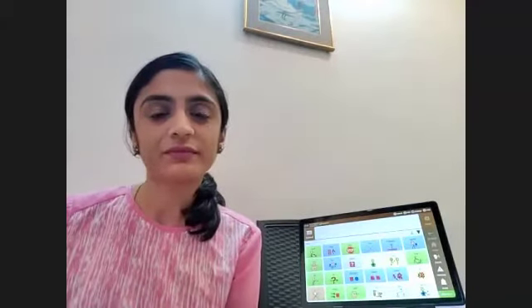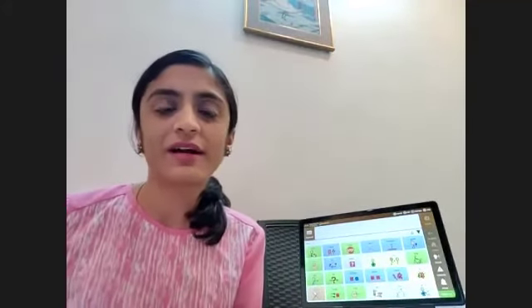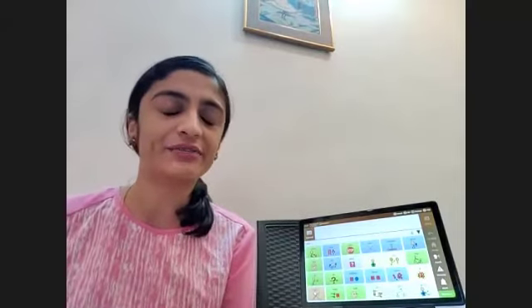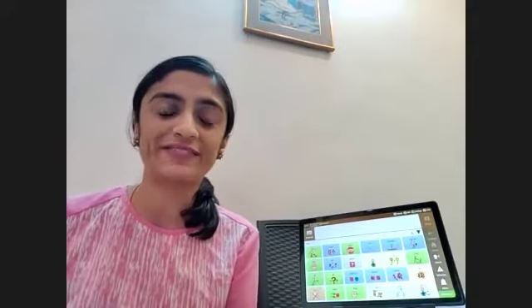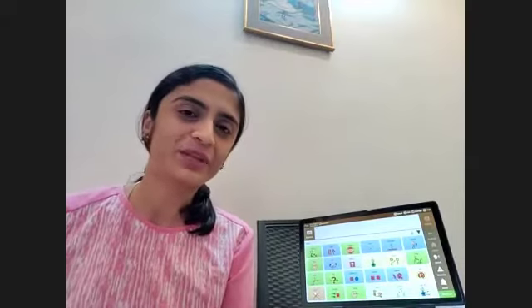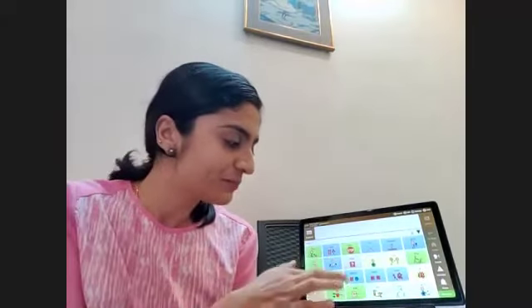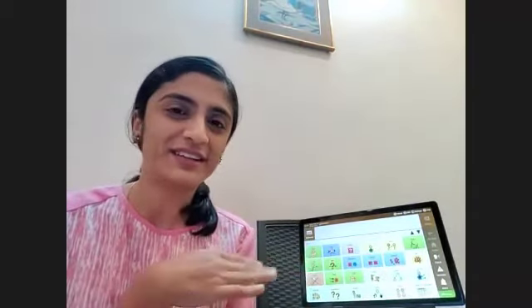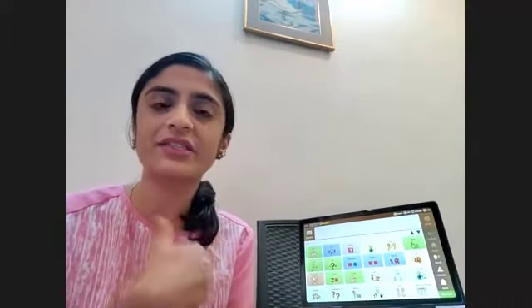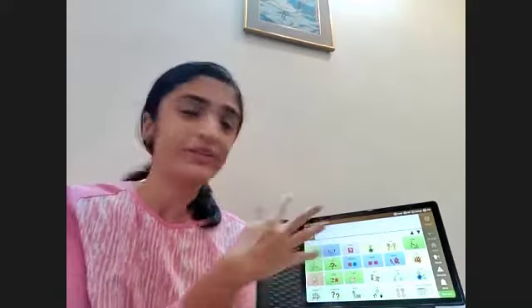Yeah, Grace has asked a very important question. Should we create separate folders for each story? No, you don't need to, because Avaz already has a very wide range of vocabulary available to us. So we can just use whatever vocabulary is there. And simple words, what we call fringe words, maybe words like the think and the plan, which I didn't have, I added in. But otherwise, we can stick to the folders that we already have, because another thing that we want our Avaz users to learn is the navigation. So, not all of it is going to be in one place.